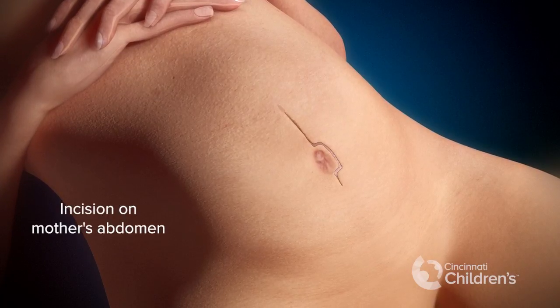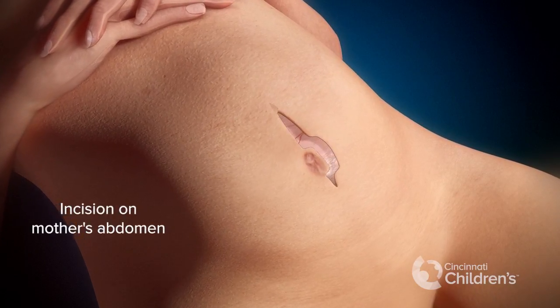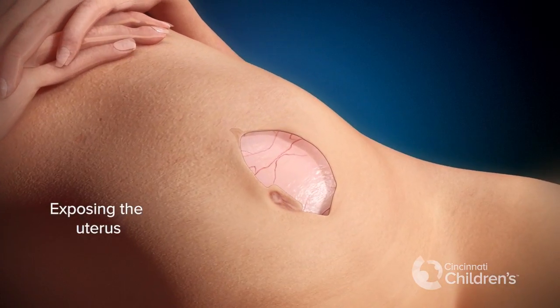The procedure begins by making an incision on the mother's abdomen. We expose the uterus through that incision.